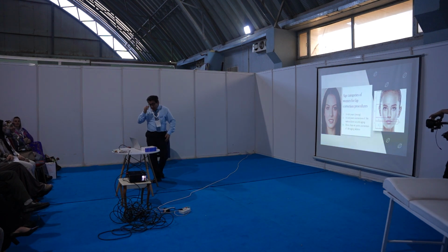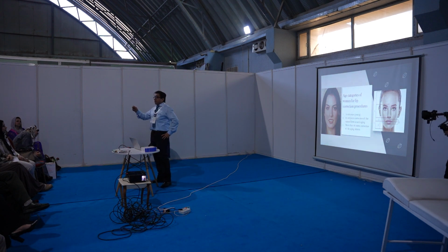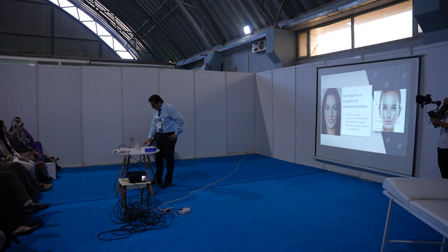Okay. So this category of the old age, usually there is needing of the contour volumization plus correction of the linear atrophy surrounding the lips due to the action of the orbicularis oris muscle.